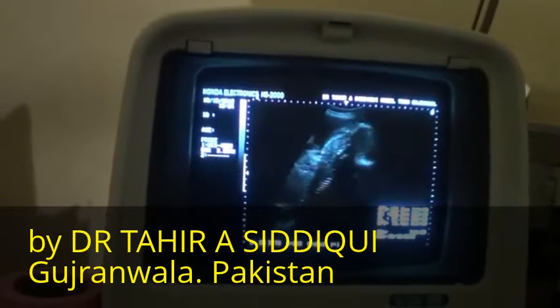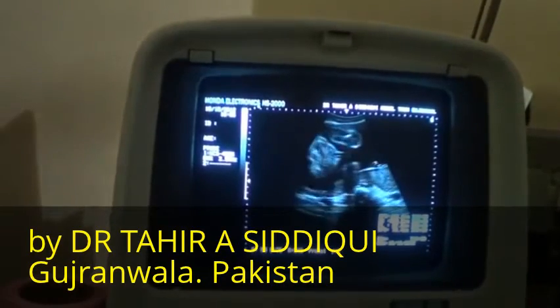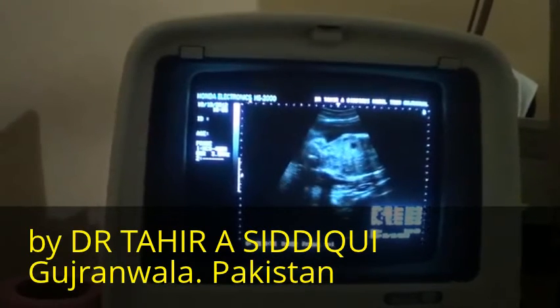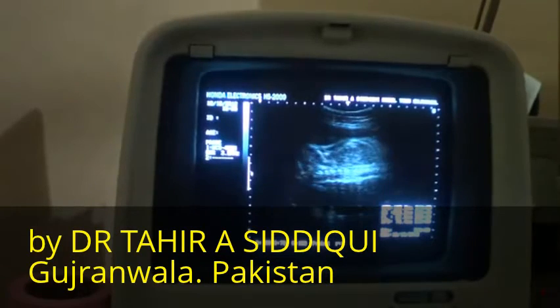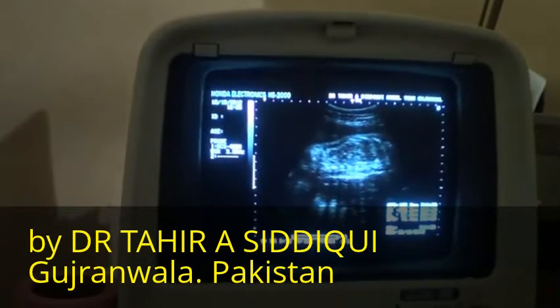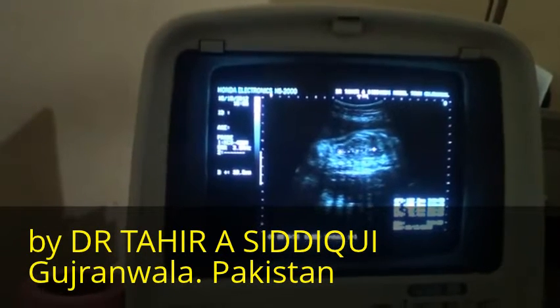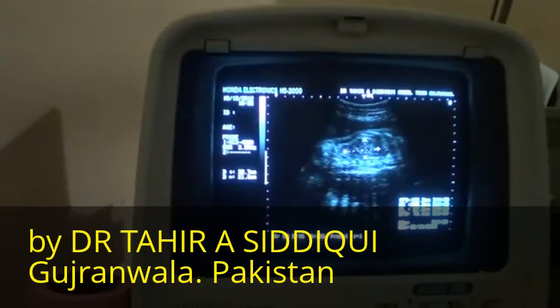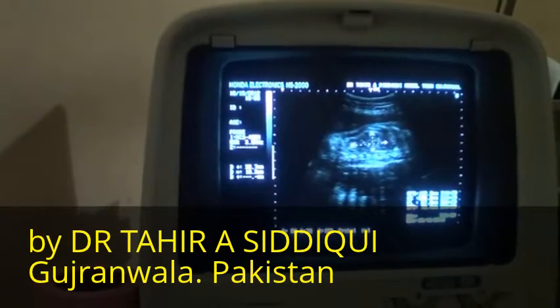Now let's try to rule out some of the important major causes of polyhydramnios. Let us see the kidneys. Now you see that this is the kidney, this is the kidney. I am going to measure it: 3.8 centimeters in length and 1.9 centimeter in anterior-posterior diameter.